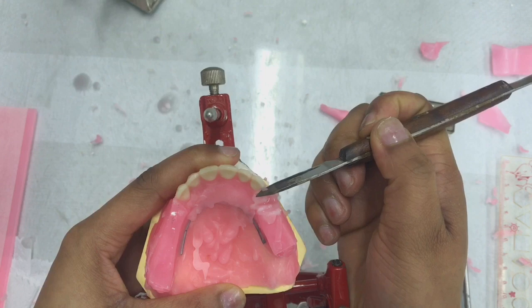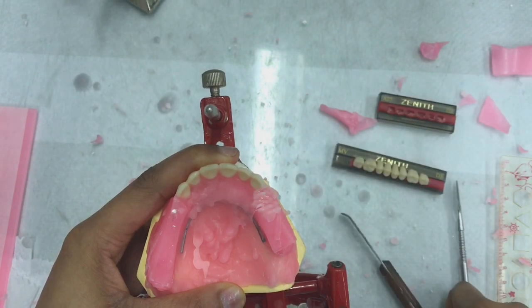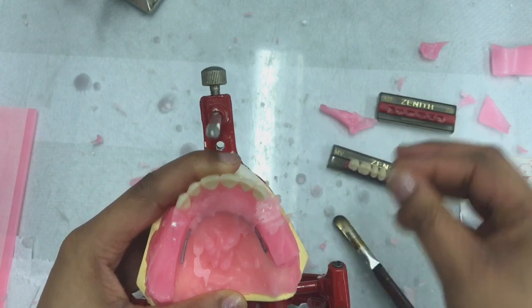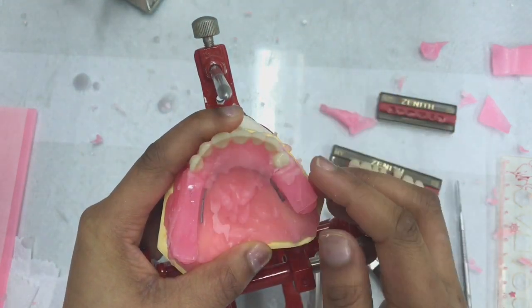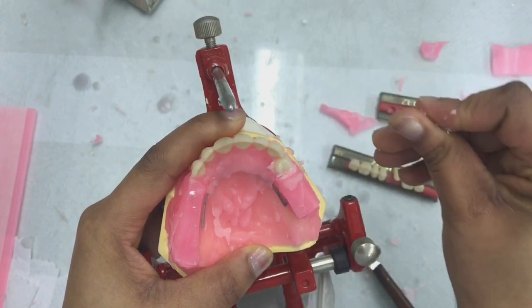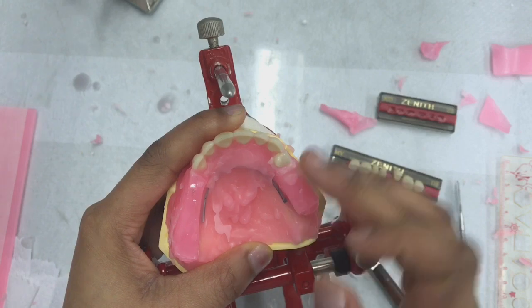One thing I forgot to mention or emphasize is that when you are setting your teeth, you must not create any diastemas. We all know that the canine is the turning point of the mouth, so it should be obvious when you are setting your premolar that the curvature of the mouth has turned.